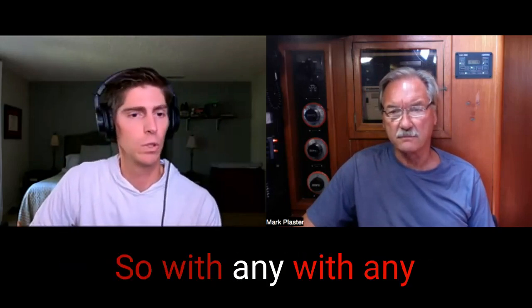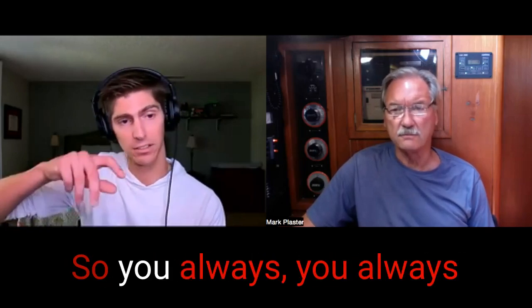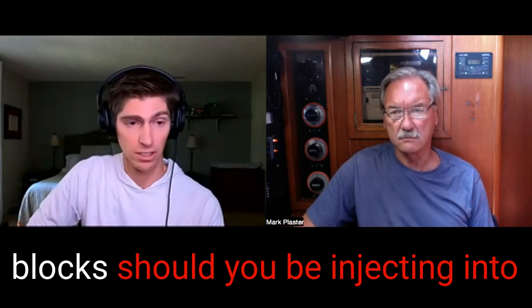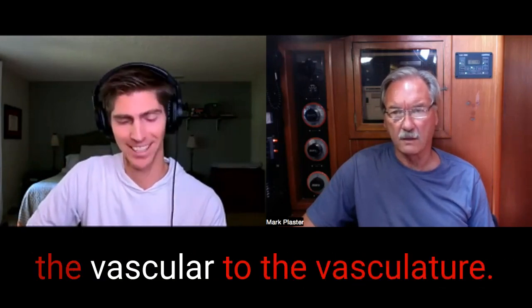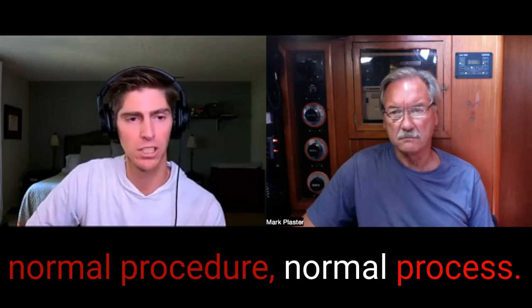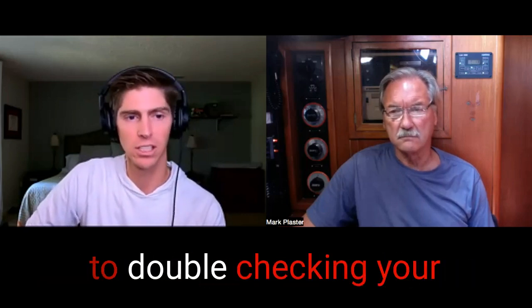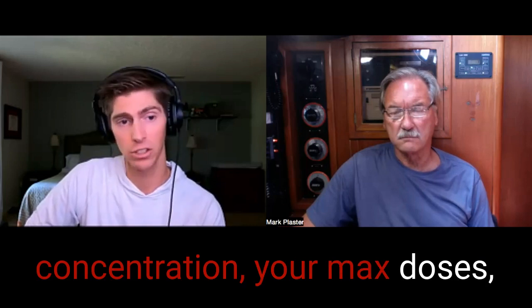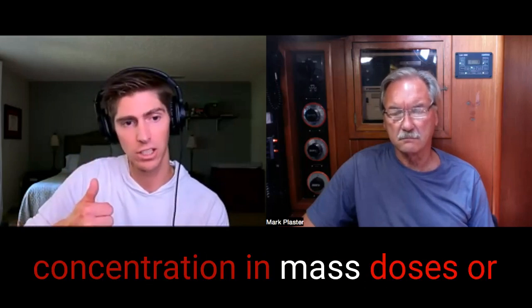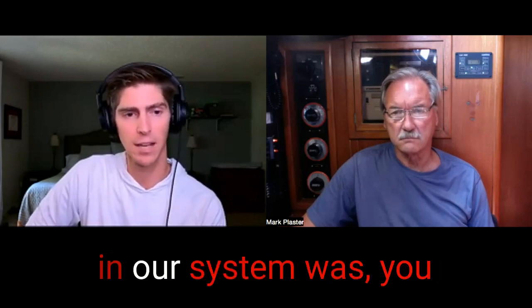Right. So with any injection technique, you always pull back. You always aspirate first before you inject. None of our nerve blocks should you be injecting into the vasculature. And so you're always aspirating as just a part of your normal procedure, your normal process. And as long as you're doing your due diligence, double checking your concentration and your max doses, it's incredibly safe. If you're aspirating correctly and you're checking your concentration and max dose, the likelihood of you having LAST is super low.